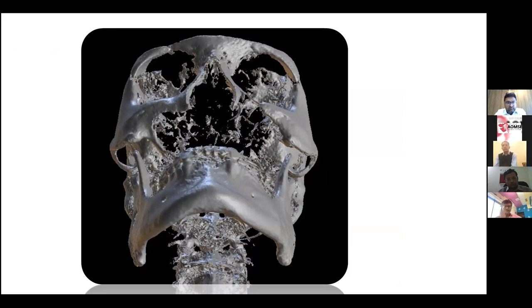So, this would be a good defect, as in what we have been working together in the team we have seen. If we have soft tissue, nothing like it, because it solves many of our post-operative problems in a very, very effective way. This is the first thing. And second would be the volume of the bone that is available to us. As is evident, we see nice zygomas here. So, depending upon the surgeon's choice, we can prefer either of the things for the rehabilitation, be it a zygoma or a PSI implant.